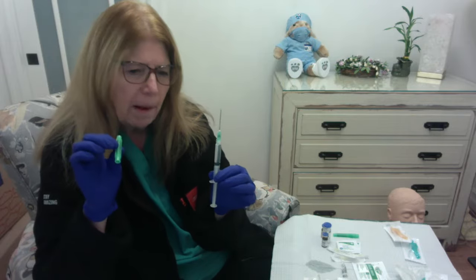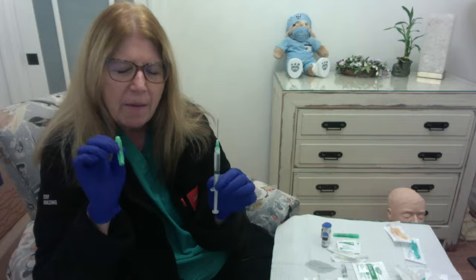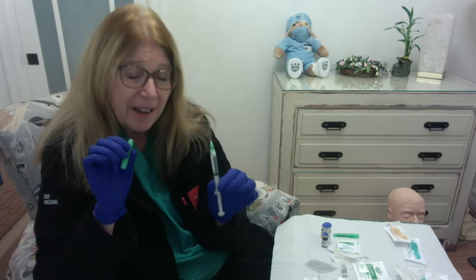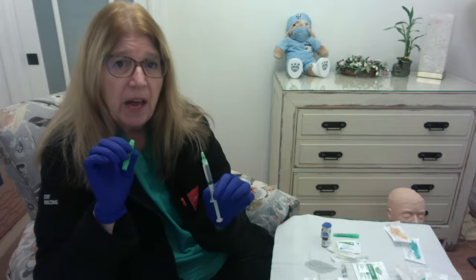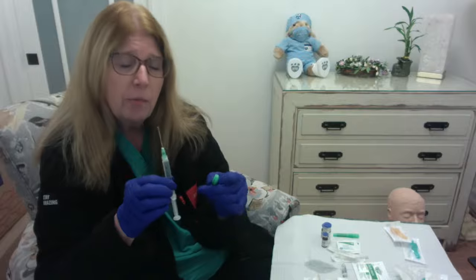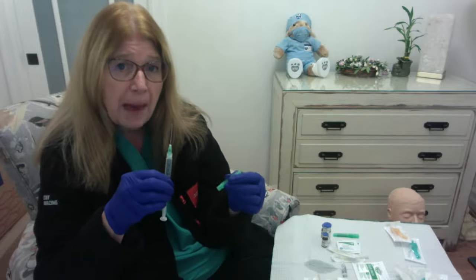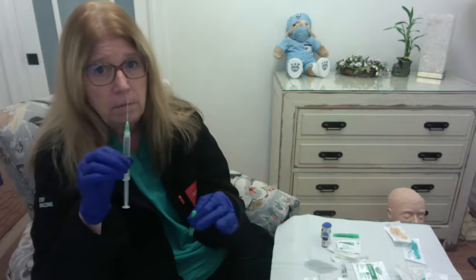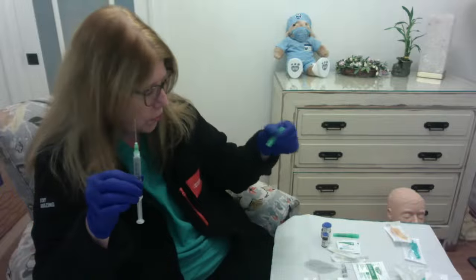So let's talk about cap replacement. We never, ever, ever want to recap a needle, particularly after we have given an injection, right? So we have a safe way to recap, and it's best to recap in this manner all of the time, whether you've just injected or you've just drawn up a medication.